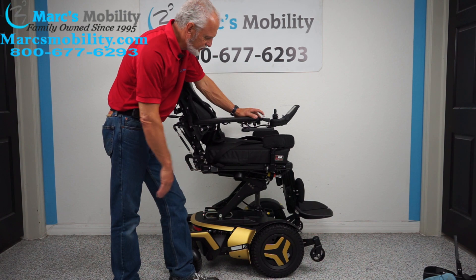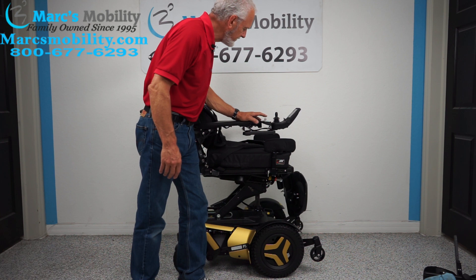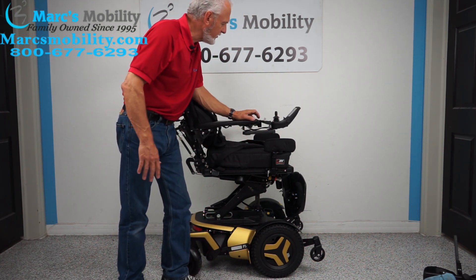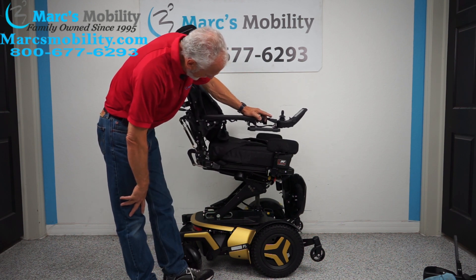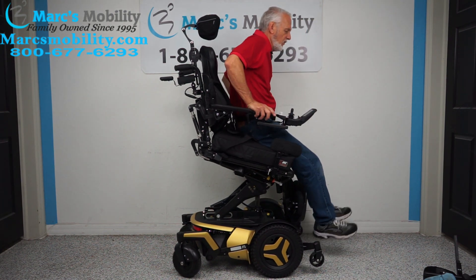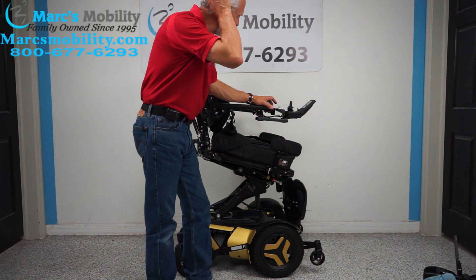If you have a person who needs to get out of their chair, flip the foot plates up and bring the legs in. Then there's the anterior tilt — the seat tilts forward. You'll see the back going and the seat tilting forward. This is called the anterior tilt. If someone has trouble getting out of their chair, with the anterior tilt you'll slide right out — you're pretty much standing and walking away from the chair. So you elevate the seat to whatever position you want and then tilt it forward.